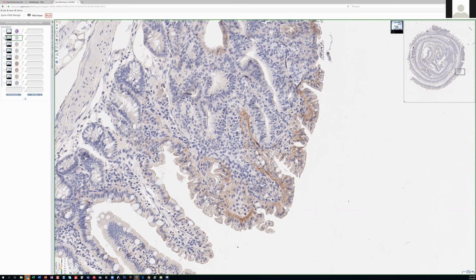Just an observation here. I'm looking at this epithelium, as Marcus said. It looks like a well-polarized epithelium, and the expression of this protein, whether it is total EGFR or phospho-EGFR, looks like it's at the base, where it is interacting with the basement membrane, the basal lamina, where the signal is coming from anyway. Do you see this pattern too? For example, if you do not have a polarized epithelium, where there is more disorganization, where do you see the staining or the labeling?